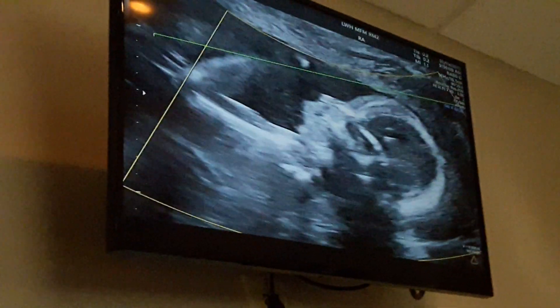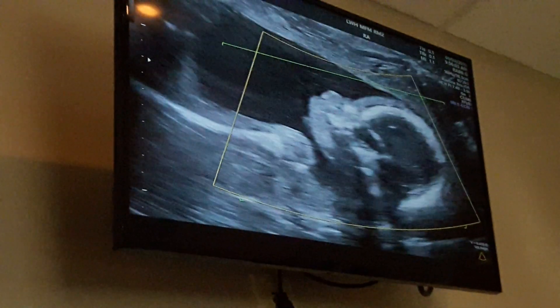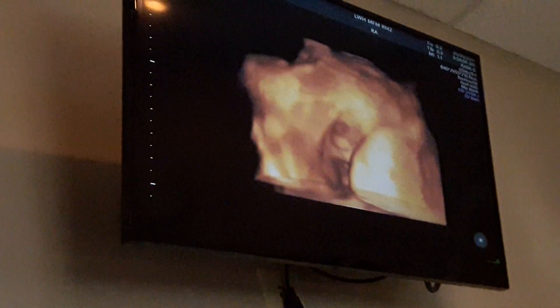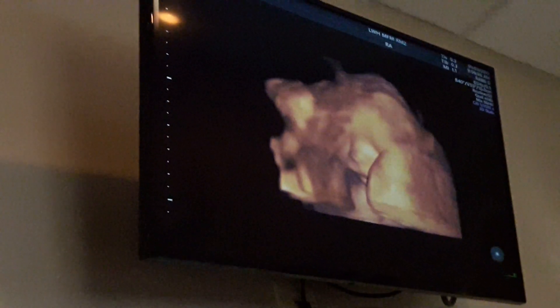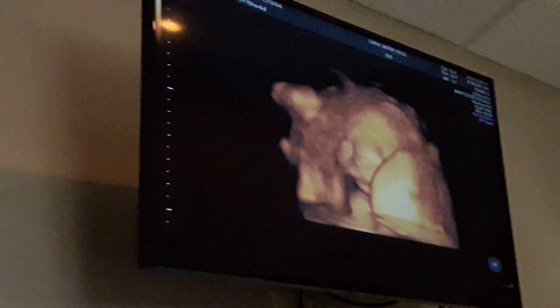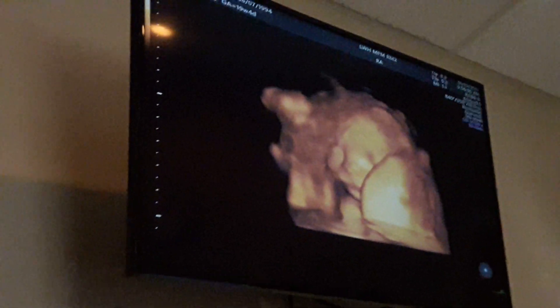So how big is it? Like a grapefruit? See how your baby is hiding? It's so cute! Look at the nose! Yeah, it looks perfect.